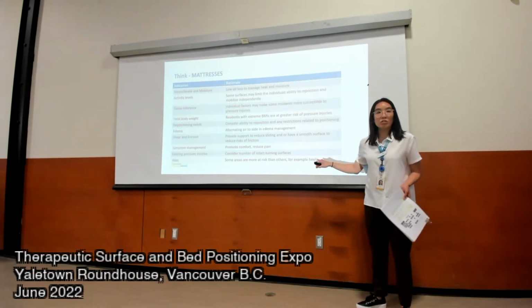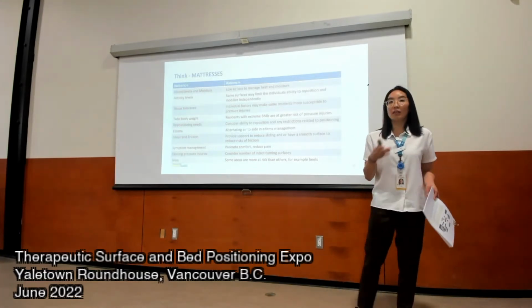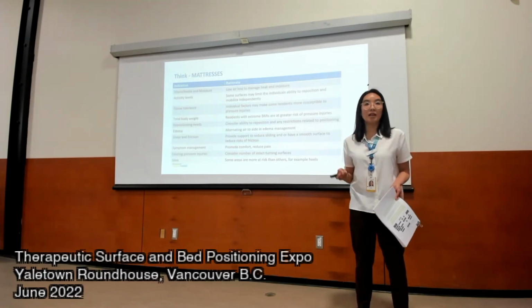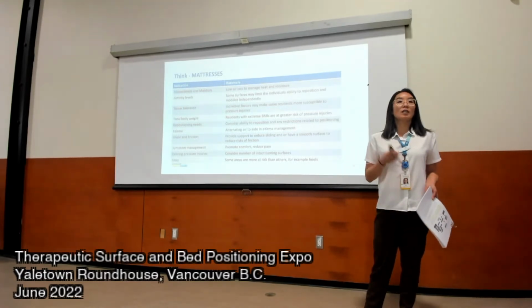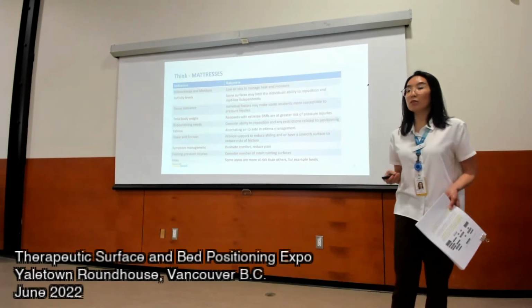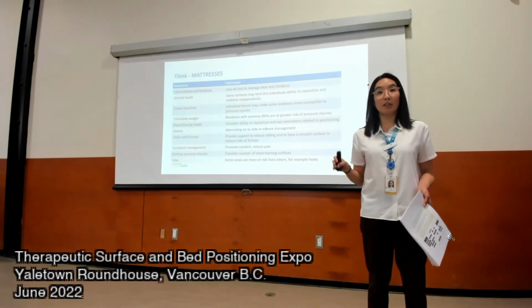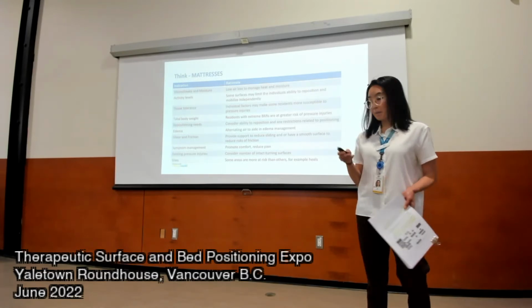Of course, existing pressure injuries, so how many intact turning surfaces do they have? And also, like what Melissa said earlier, even if they have a previous pressure injury, and it's been healed, it's only going to heal to a maximum of 80% of that skin's initial integrity. And then lastly, the sites. So you just want to be aware of what sites on the resident's body are going to be at risk of skin breakdown. And even if you have a low air loss mattress or a fancy mattress, you're still going to want to do a hand check to make sure that that resident is not bottoming out in all those areas of concern and in all the positions in which they will be lying on the bed.